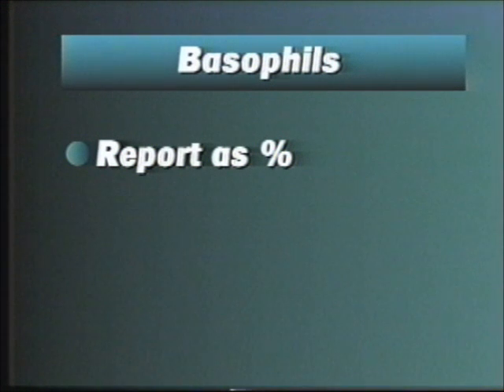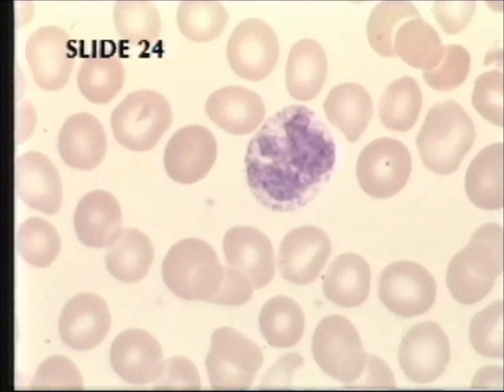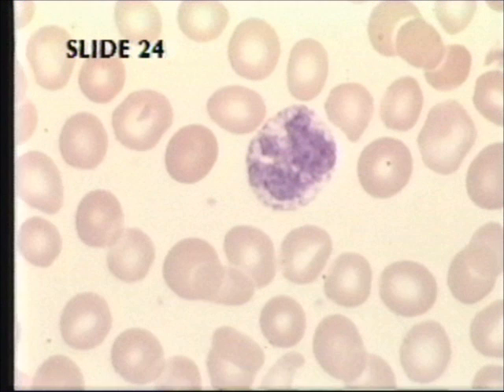Basophils are also easily identified by their numerous, large, dark staining granules. Even in cases of heavy toxic granulation in the neutrophils, as you see in the cell on the left, the basophil on the right is easily identified, if your stain is good. However, if there is moisture in your stain or fixative, the basophil may look like this. This would be difficult to differentiate from toxic granulation, especially if it occurred sporadically throughout the smear.